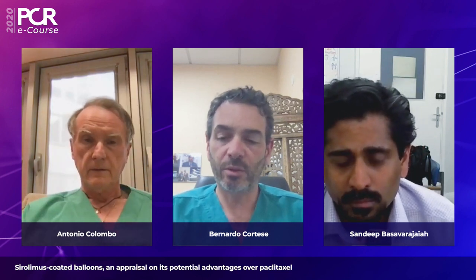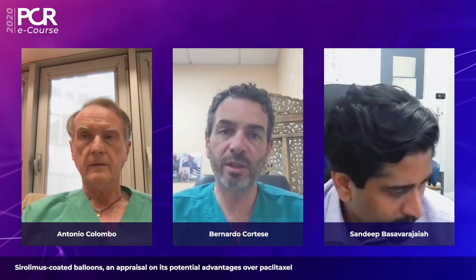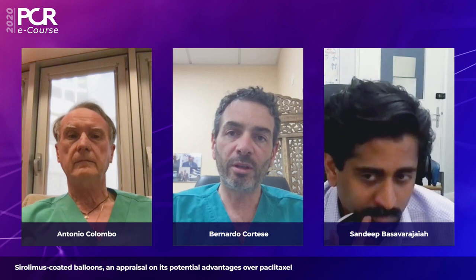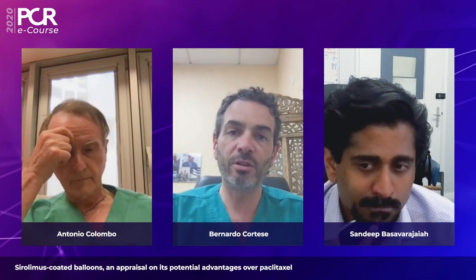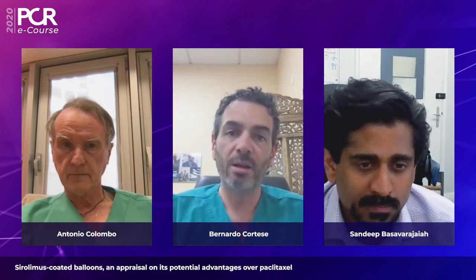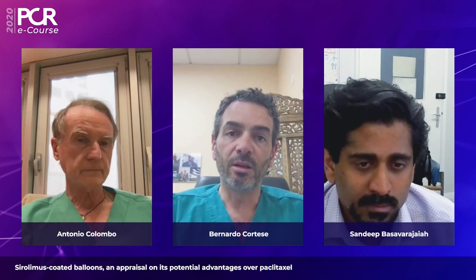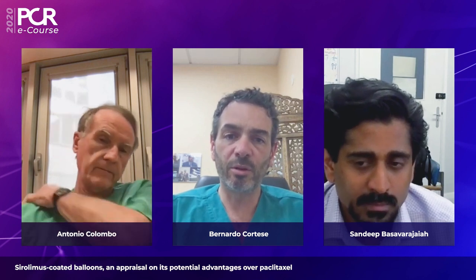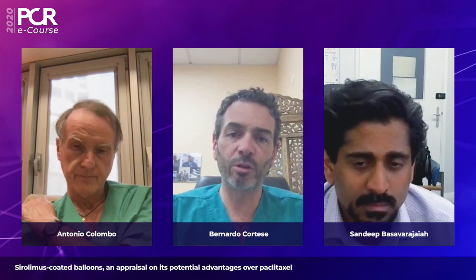What about your experience with native vessel disease? So we started using drug-coated balloons for in-stent restenosis 10 years ago. Now we have seen some data that show that DES is probably better, not only in terms of angiographic follow-up, but also in terms of TLR, which is a hard endpoint for us, for this type of lesion. We have also seen that sirolimus seems to work well in the ISR setting, also because in this registry they are not very simple in-stent stenosis lesions, so they are more diffuse. We also included, for example, some total occlusions.